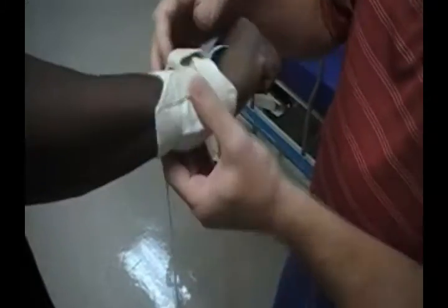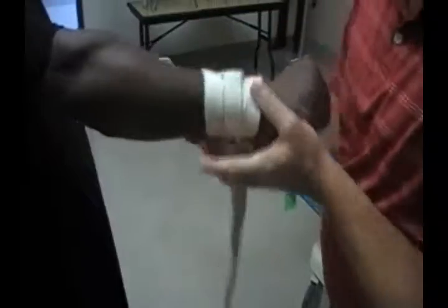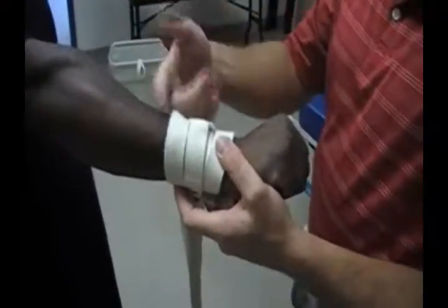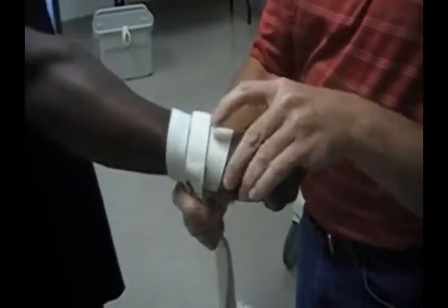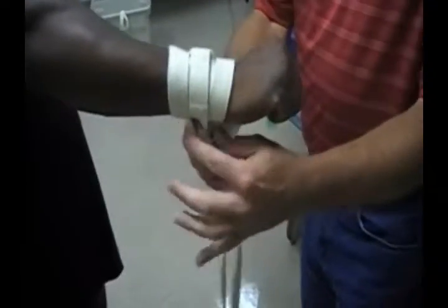No creases — it's nice and smooth on the body. When we turn this down, it's there. I should be able to get my finger in here to check; I'm using my pinky depending on your finger size. You don't want it super loose, but you don't want it super tight to where the fingers start to turn blue.